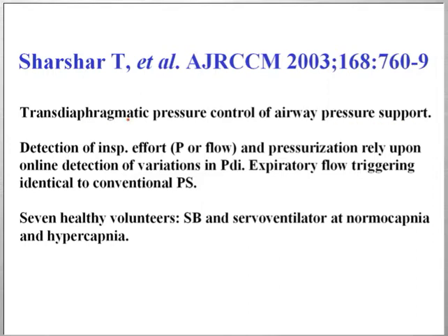This is another investigation in which the authors wanted to analyze whether or not pressure support ventilation could be controlled by transdiaphragmatic pressure. And in this study, the detection of the inspiratory effort, either by a signal in pressure or in airflow, and the pressurization during the full inspiration rely upon the online detection of variations in transdiaphragmatic pressure. And the expiratory flow triggering is identical to conventional pressure support. So it's a conventional cycling from inspiration to expiration with a flow signal.